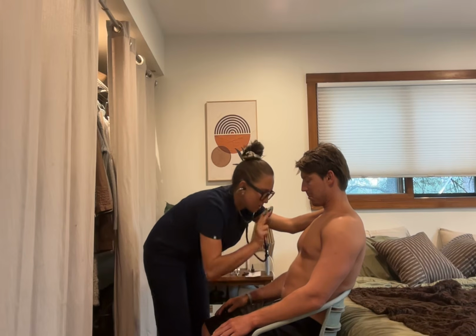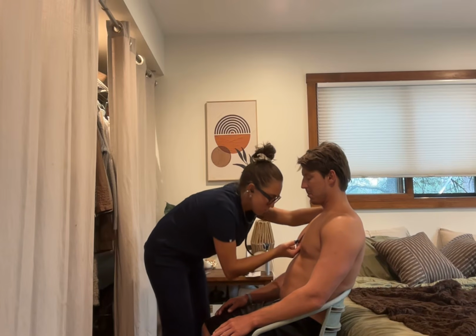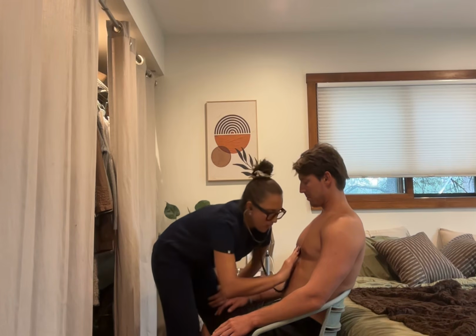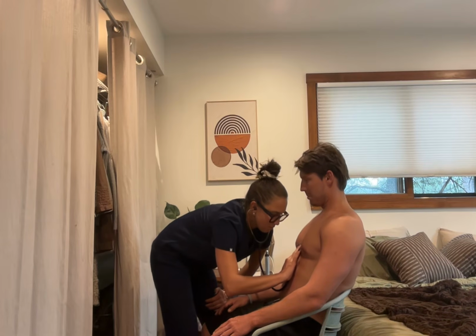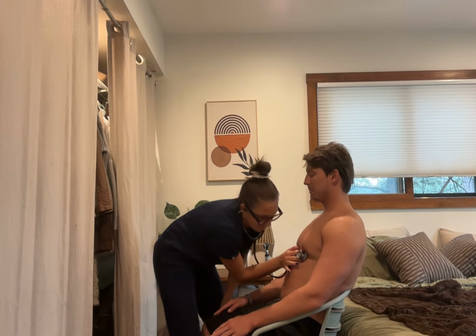Good. And with the pulmonic, I'll use the diaphragm and the bell. Good. Moving down to Erb's point with the diaphragm. Good. Moving down to the tricuspid with the diaphragm and the bell.